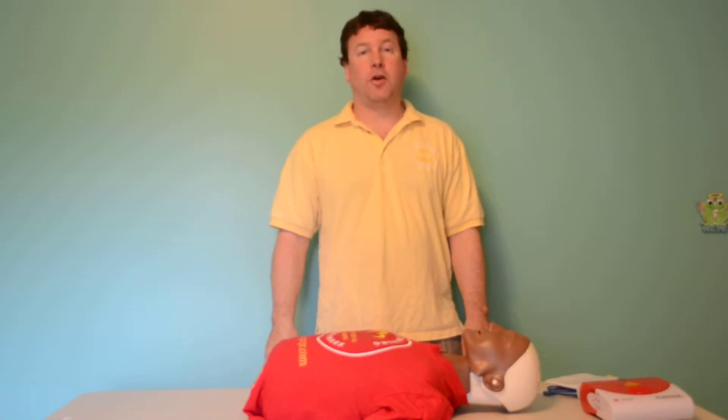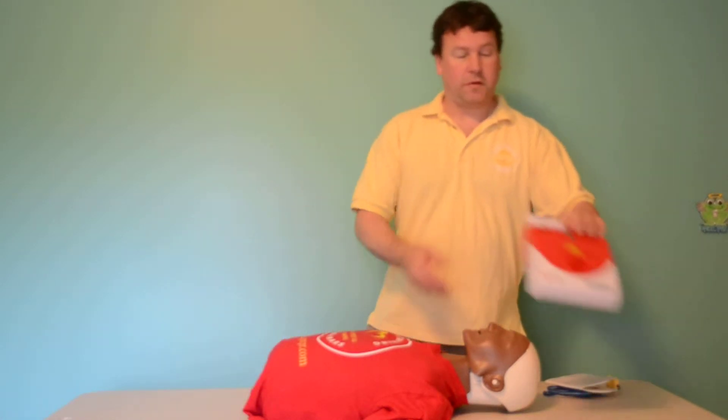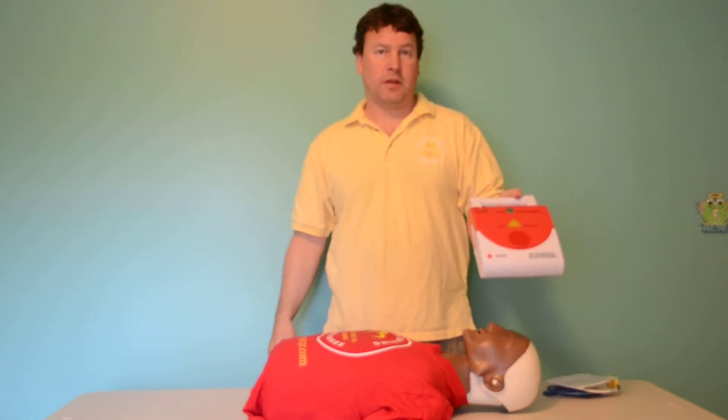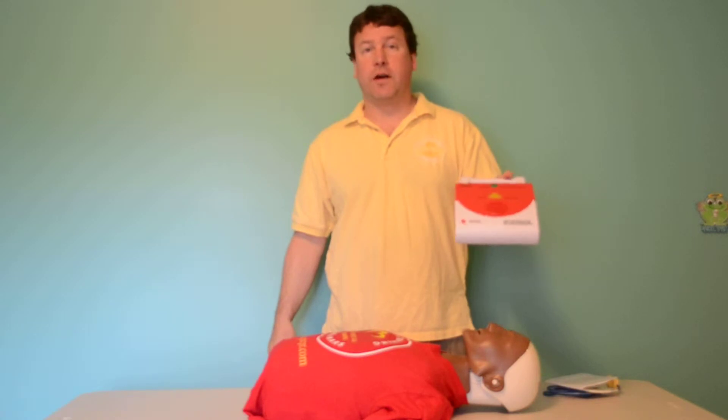How to use a defibrillator on an adult. When a defibrillator is on the scene, turn it on. This is a training device only — no shock will be delivered. Turn the AED on and follow the directions.